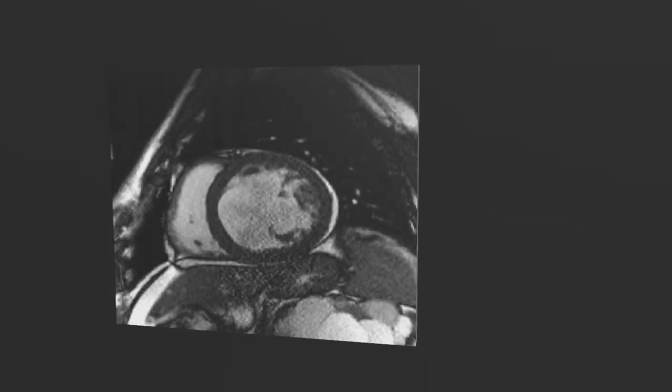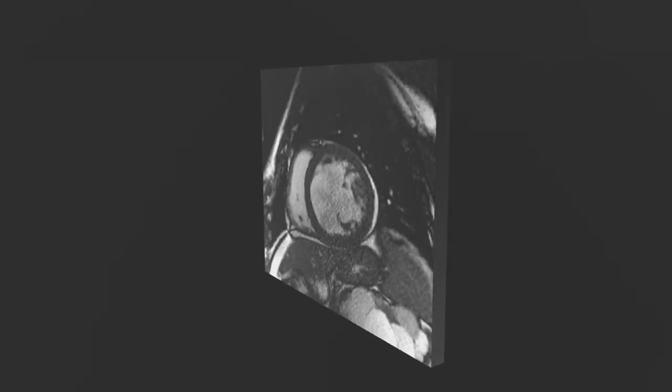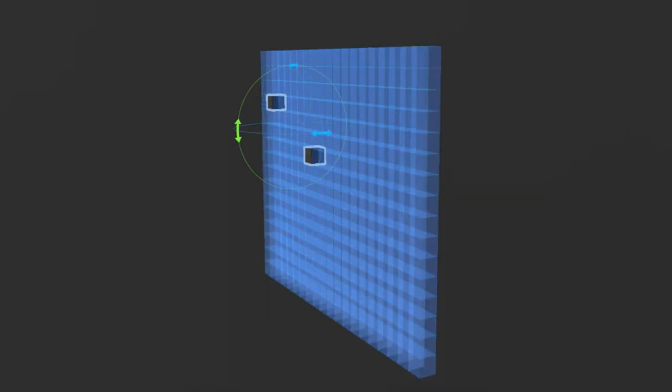So if we see this single slice of the MRI scan of the heart, we see that it is composed of multiple voxels.